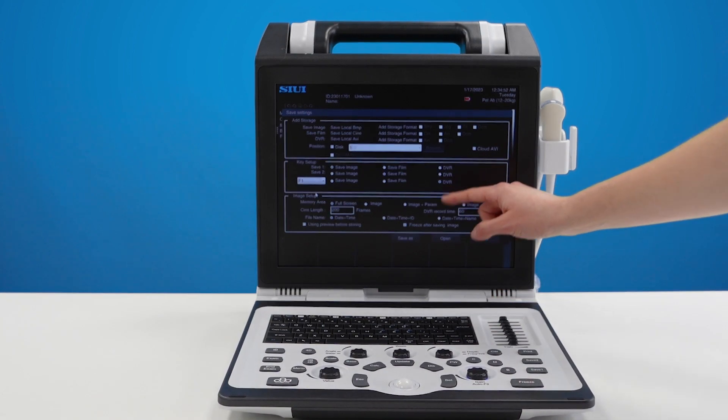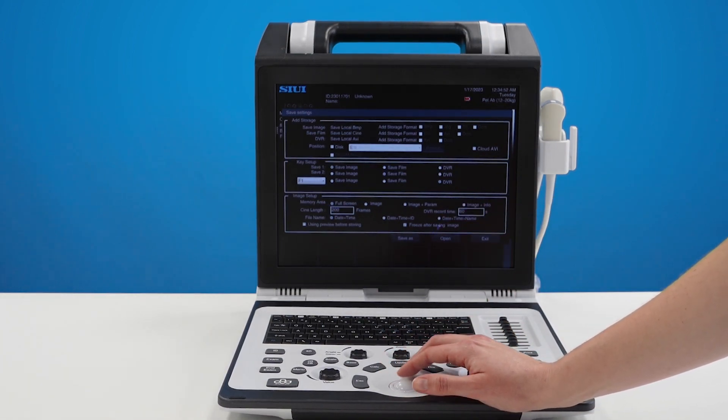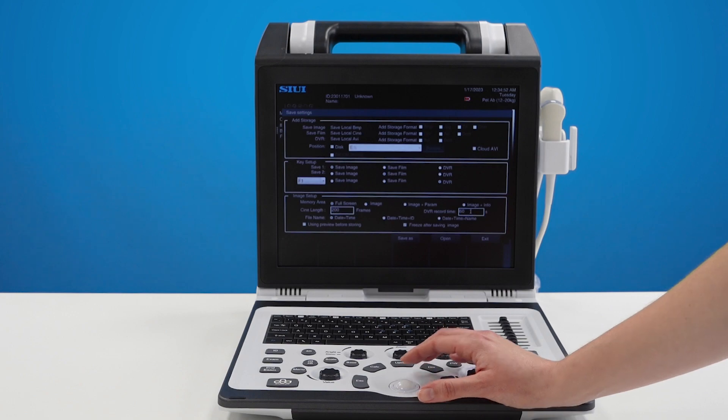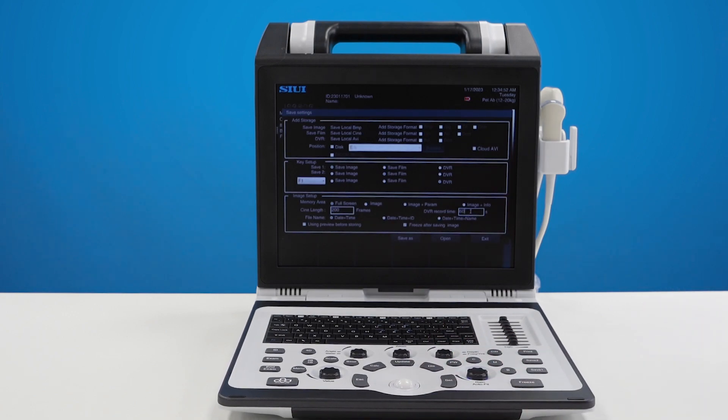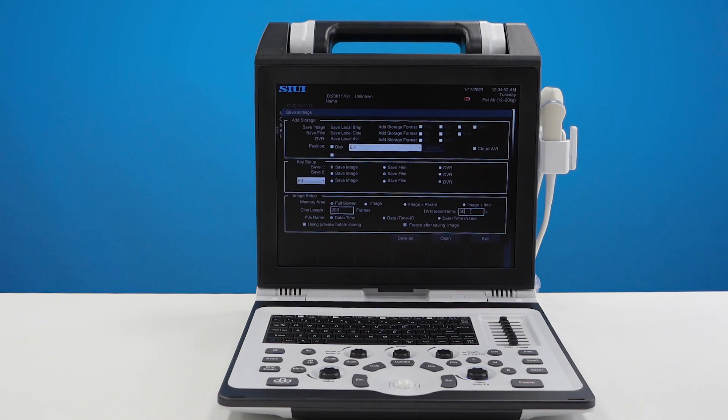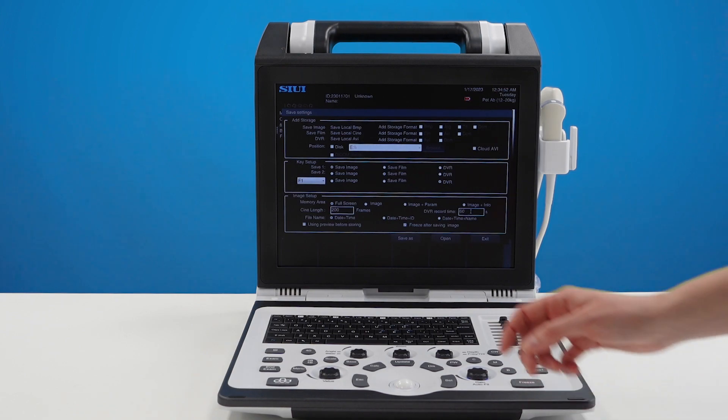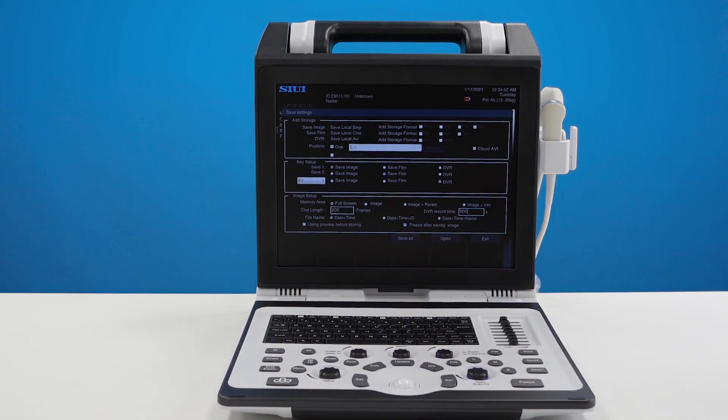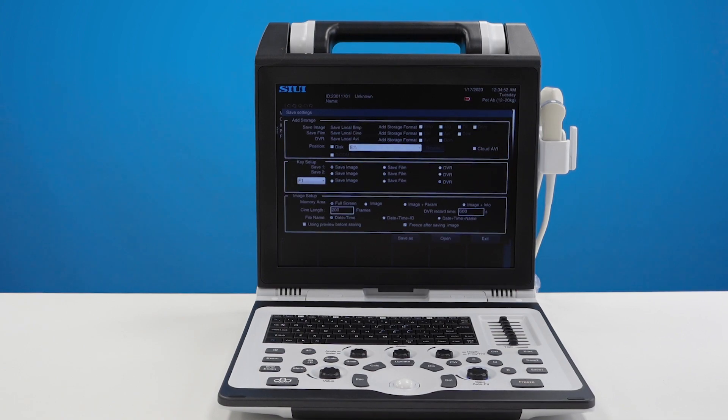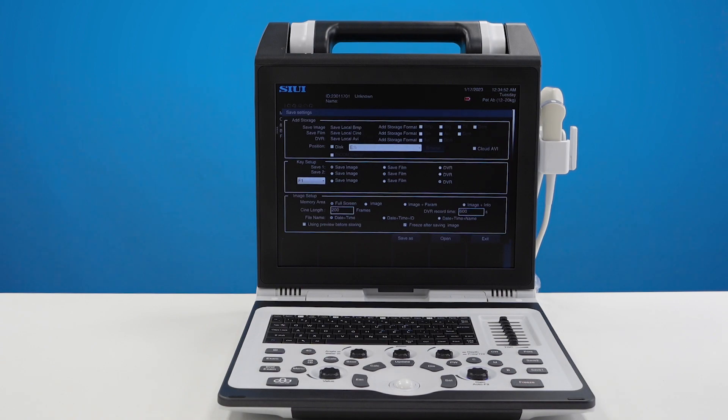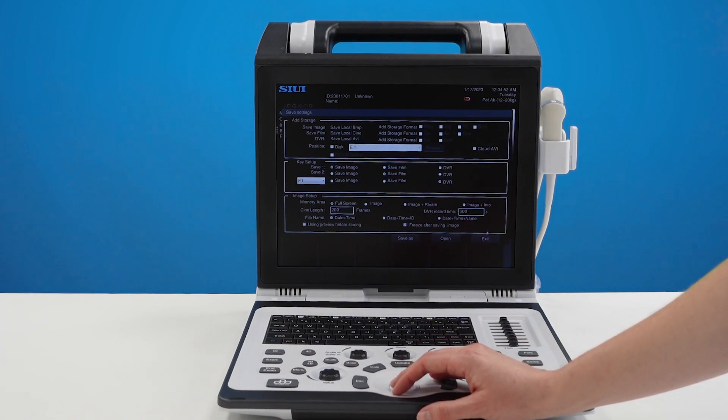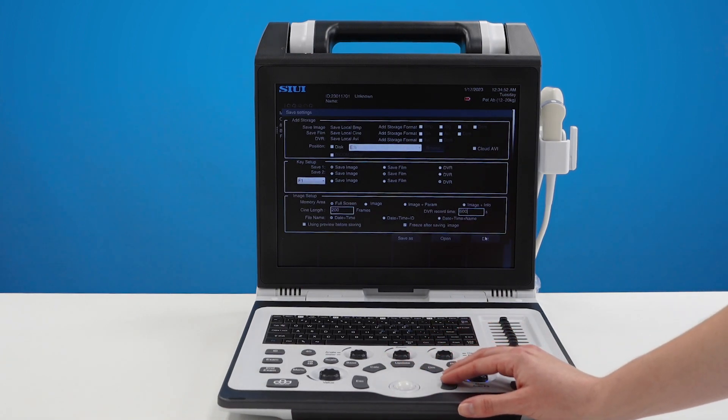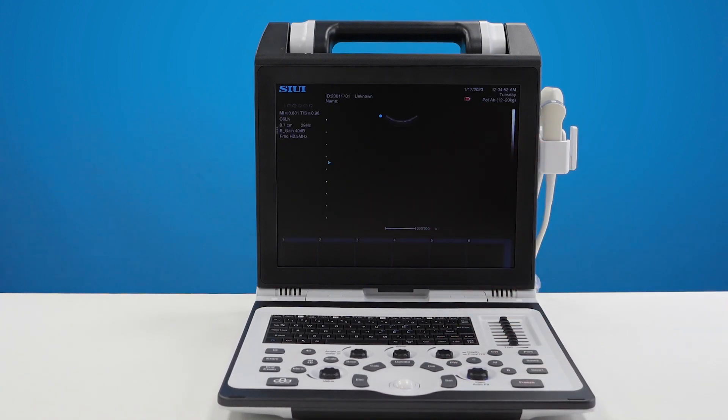DVR will already be selected and now you just need to go down here to DVR record time and set how long you would like your long recordings to be. I want mine to be very long so I just add a zero at the end 600 seconds. It's very unlikely I'll ever get to that length. I'll probably end up freezing or pressing F1 again to stop my recording long before I reach that time. Once you've done that go to exit and set and your machine will now be set up.